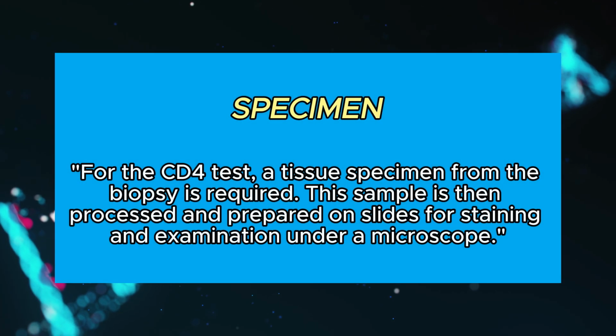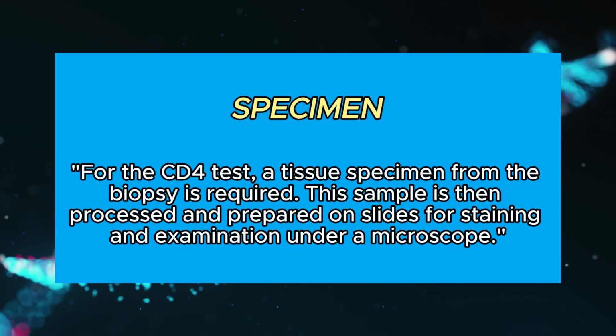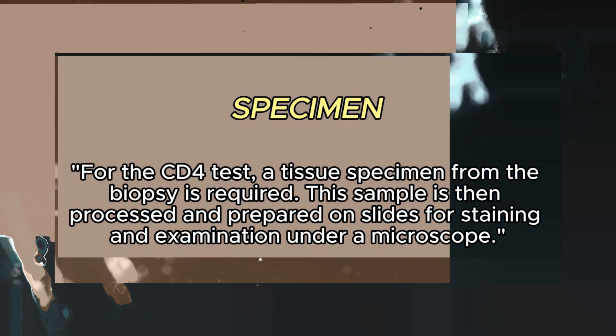Specimen used. For the CD4 test, a tissue specimen from the biopsy is required. This sample is then processed and prepared on slides for staining and examination under a microscope.